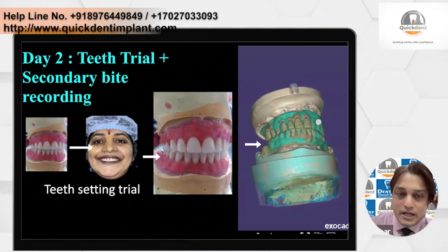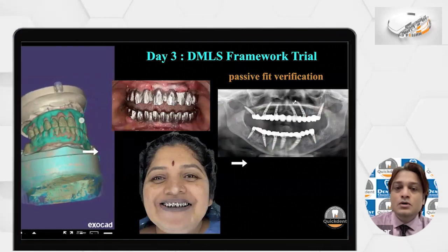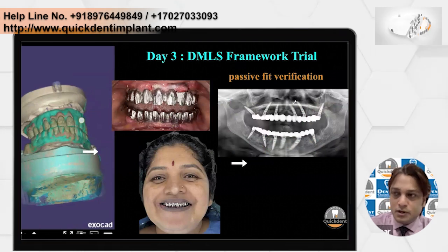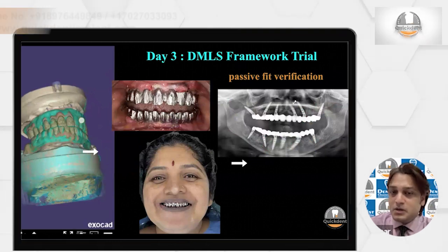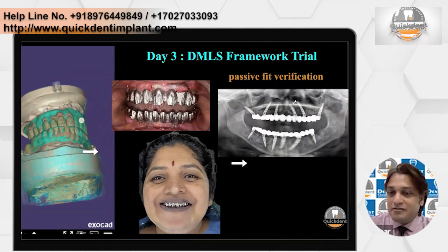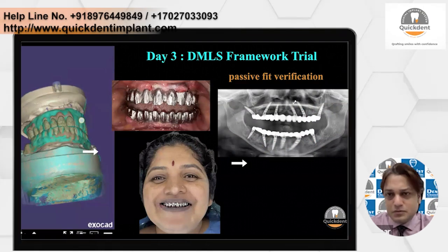He will scan it with the extraoral scanner, and according to that he will get an idea and do something called the cutback technique, where he will reduce the thickness for the ceramic, and he will print the metal, that is the metal framework. And this is nothing but what we call a framework trial. Again, we will check with a one screw test whether everything is perfectly fitting or not. That is something which we will do on day 3. This is called the framework trial. That is how we do it.